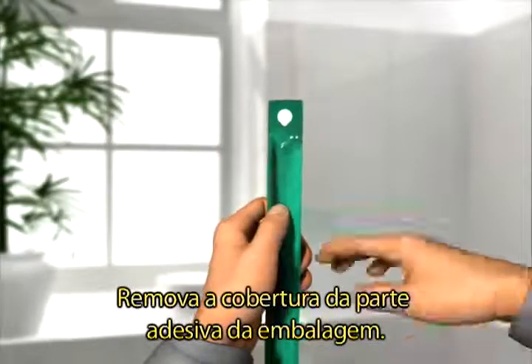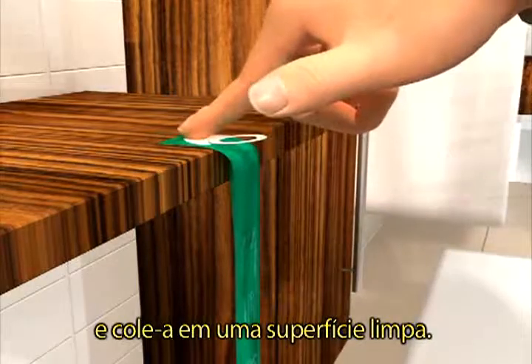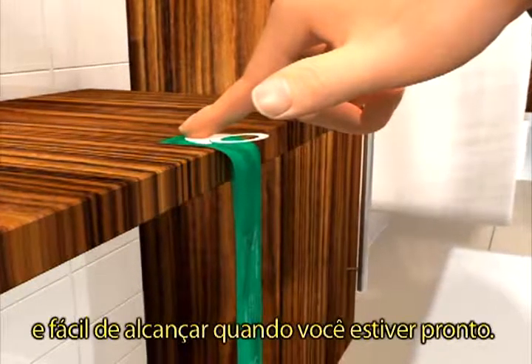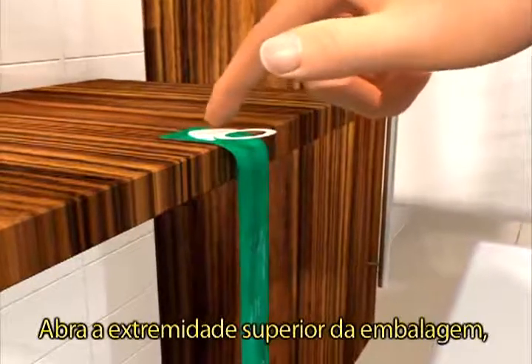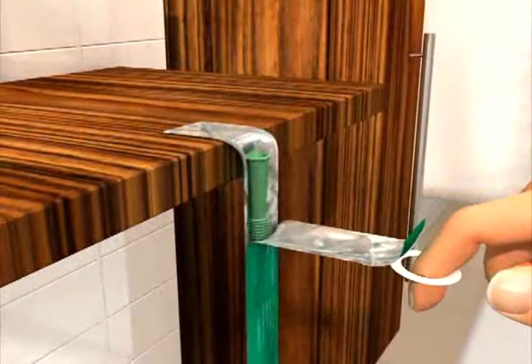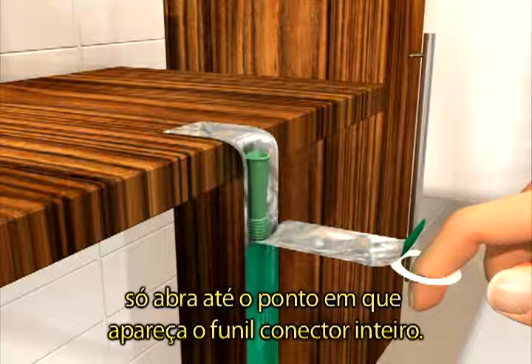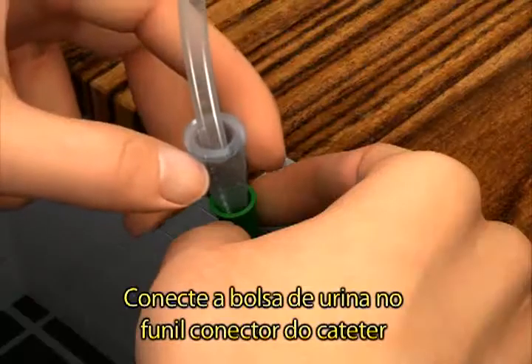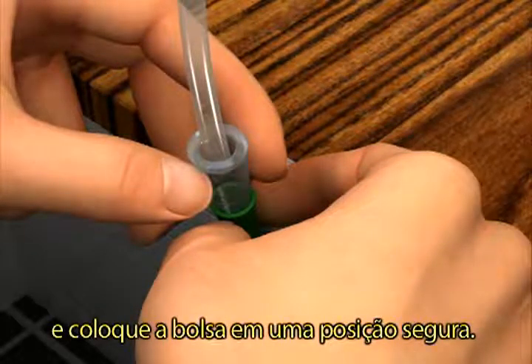Remove the cover label from the adhesive spot, then attach the adhesive spot to a clean surface. The pouch must hang vertically so that you can easily reach it when you are ready to use it. Open the upper end of the peel pouch by pulling the ring towards yourself and then downwards. Only peel until you see all of the funnel connector, to avoid spillage of the liquid inside the pouch. Connect the urine bag to the funnel connector at the catheter and place the urine bag in a secure position.